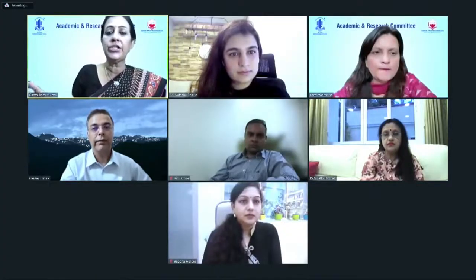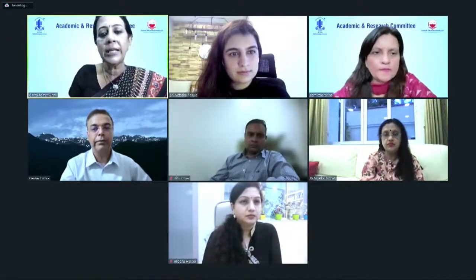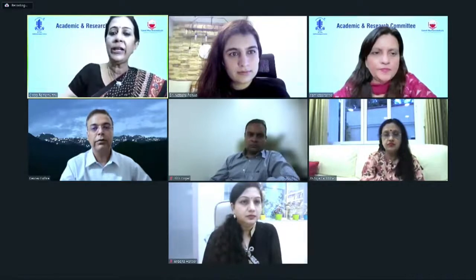No, but on an Alcon platform, sometimes you enter it as zero refraction and you regularize it. Then if you see that the tissue consumption is less, I still feel that I would opt for that as against TREC. I would look to TREC for even thinner corneas when I can't do a topographic regularization and would otherwise do just a CXL. Then I think TREC has a role to play.